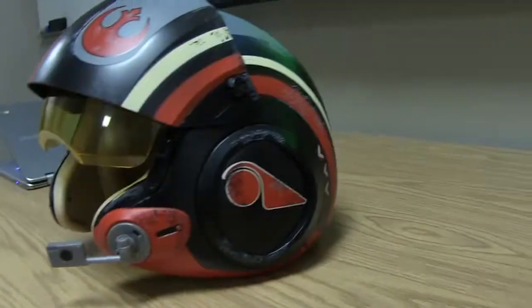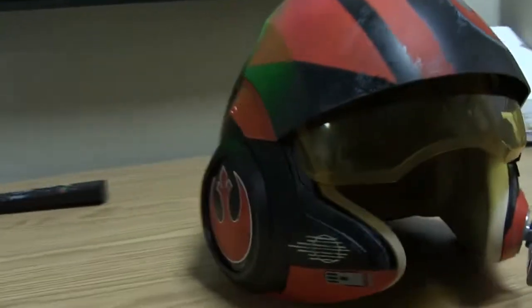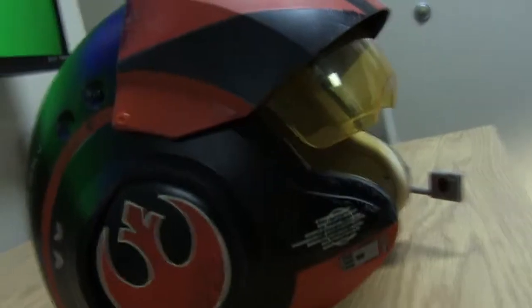To further enhance the gamification, we think it would be super interesting to tie the game to a popular franchise like Star Wars. This setting also allows for the BCI to be embedded in a fighter pilot helmet, which would make the device more approachable for children.